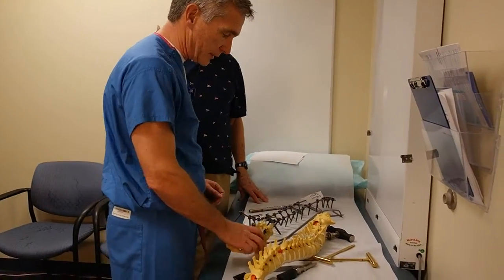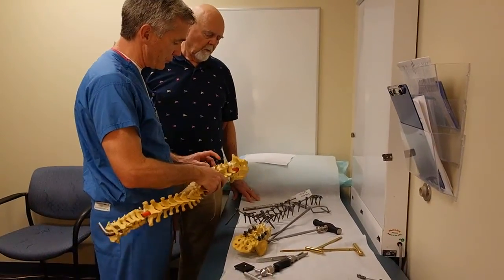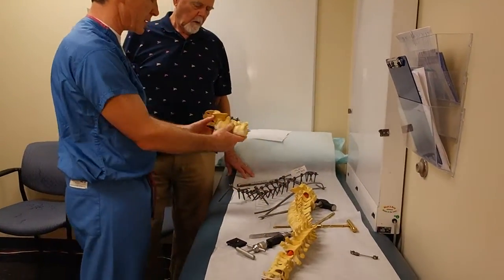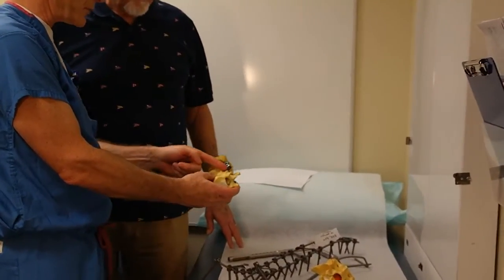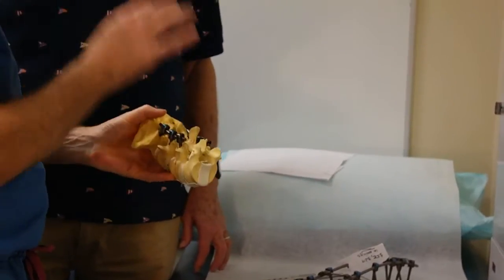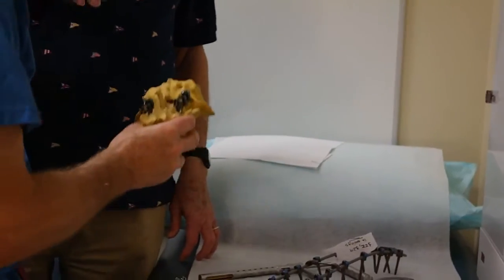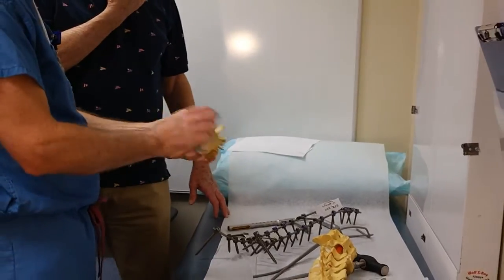The first thing we have to do, Leslie, is make the holes in the bone. The place where we put the screw is right here in the pedicle. This shows where the screw goes down into the pedicle. For that we make a small burr hole, and then we have a special pedicle finder which wiggles its way down into the pedicle. Then we have a ball tip where we can feel down the hole to make sure we're inside the bone. Then we actually have taps, like you have for wood or metal, and we put threads in there.